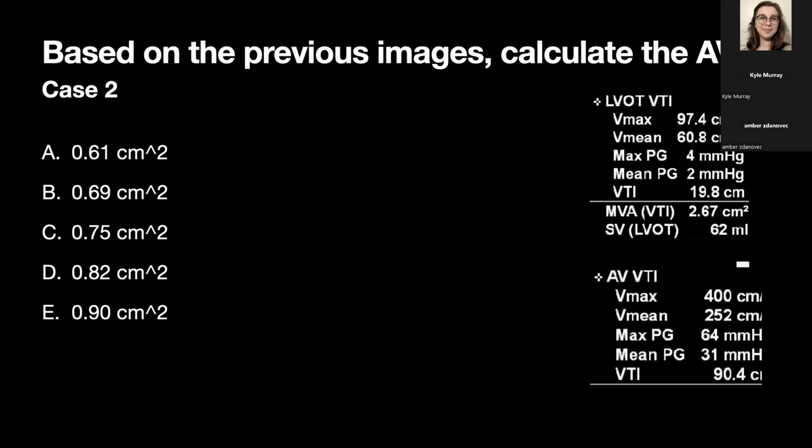Oh, LVOT. Do you need it, given the information you've been given? So what do you use the LVOT diameter to calculate? Well, it's for your valve area, yeah. But why do you need your valve area, or why do you need your LVOT area?